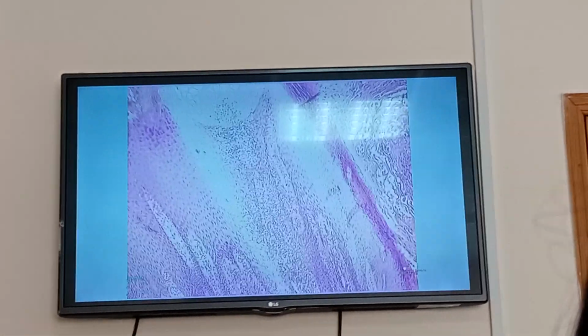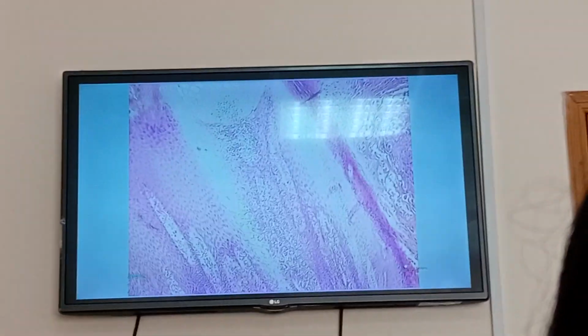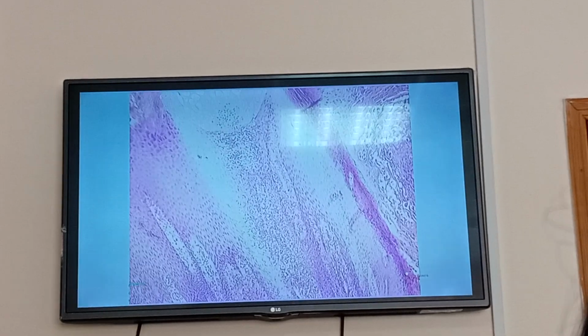So this border line, also known as acanthosis, between different compartments of this virus. This is a pox virus. It's called molluscum contagiosum of the skin. It's due to pox virus, DNA virus. You understood what this pox virus is? Yes, of course. Continue.